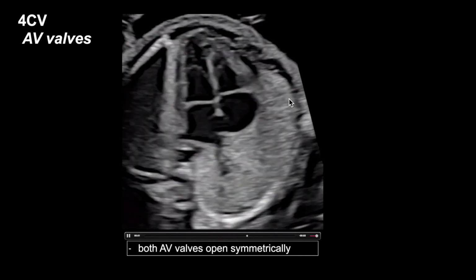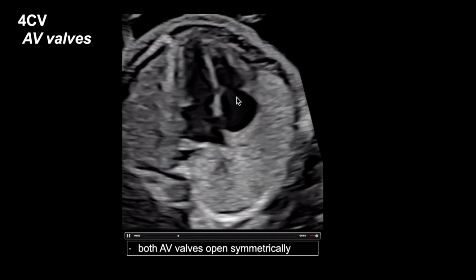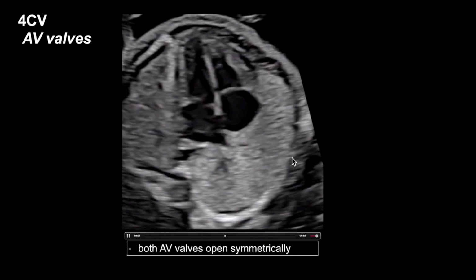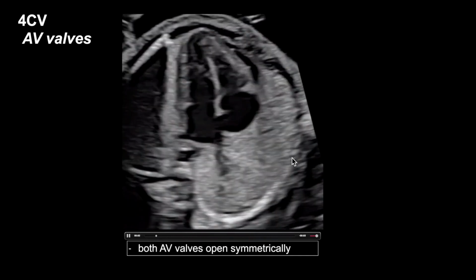So the next thing I'm going to do is start to zoom in a little bit more and really look at these AV valves. I'm in a great angle of insonation coming in the apical 4-chamber view, and I just want to see them move open and move symmetrically.